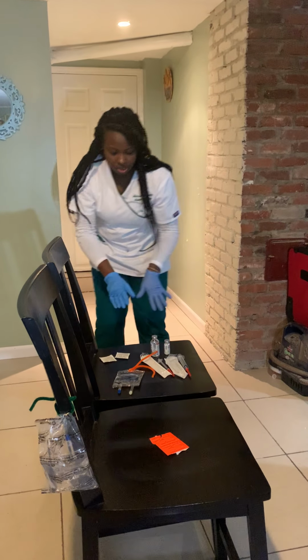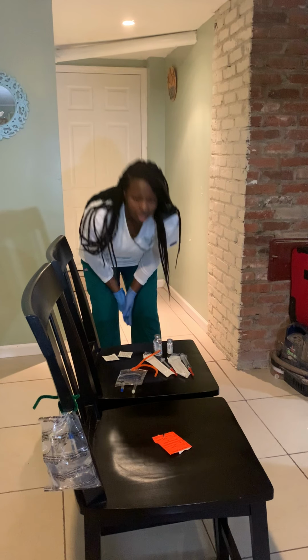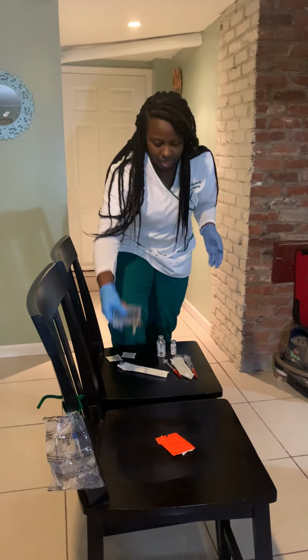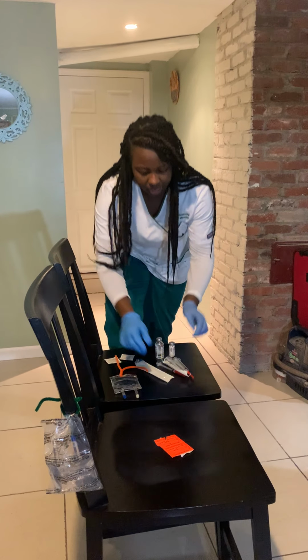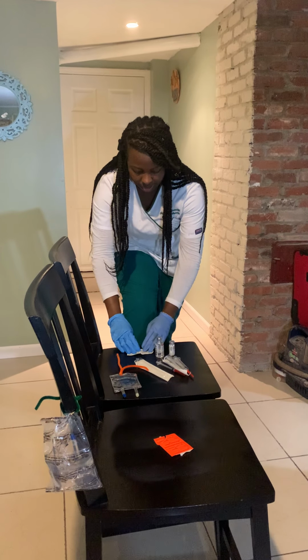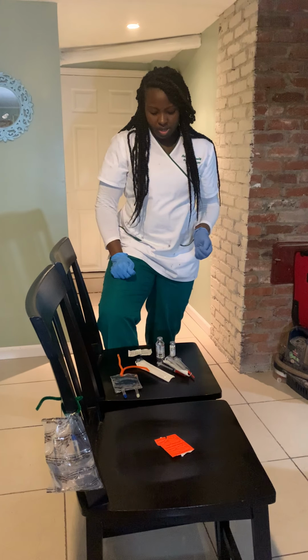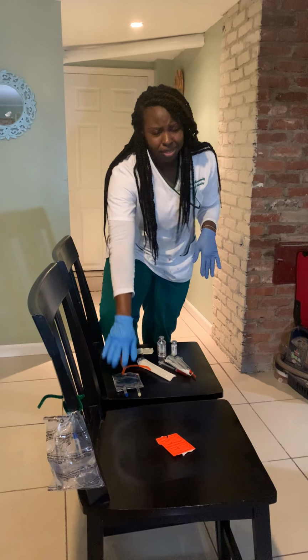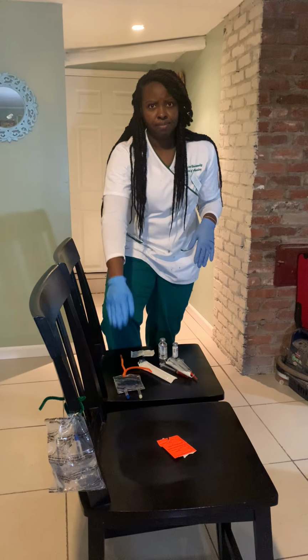So far, so good. I'm also going to have a bag of normal saline, my 2 syringes, and for aseptic technique, alcohol wipes. And my piggyback sodium chloride pouch, which I mentioned.